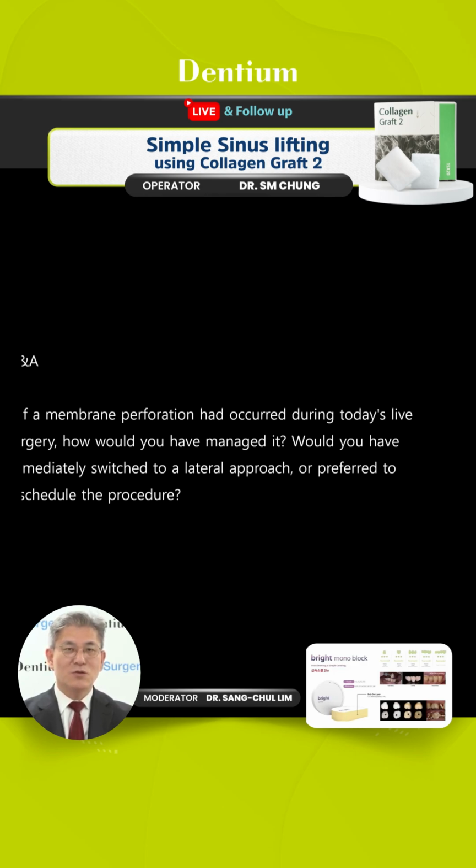Depending on these two causes, the area is successfully covered and overcome when you have a small perforation during the crestal approach.